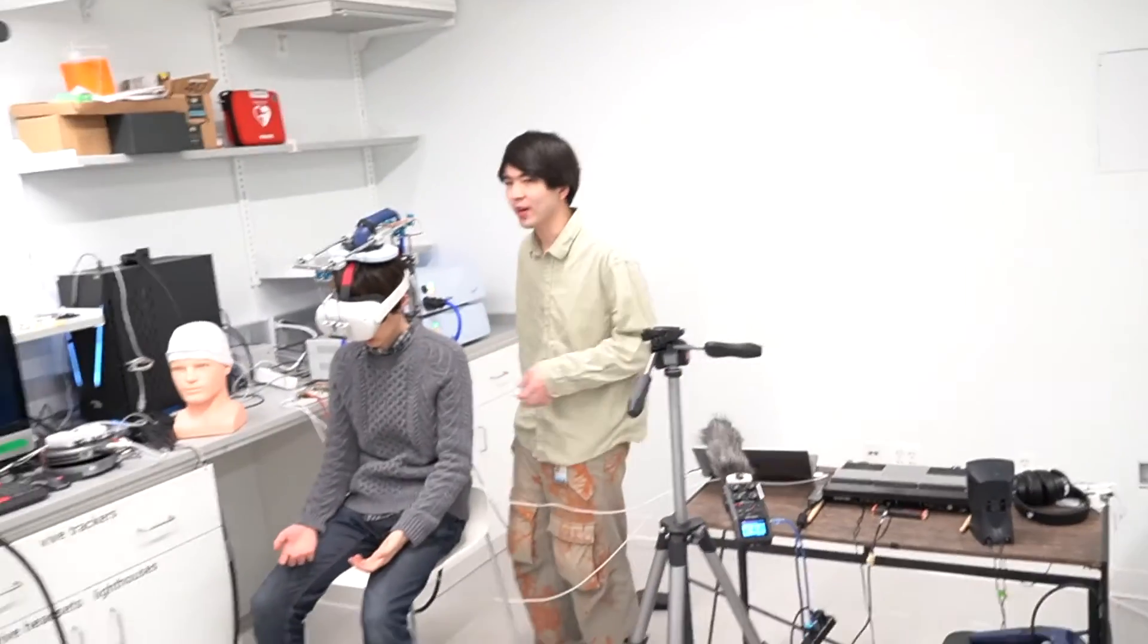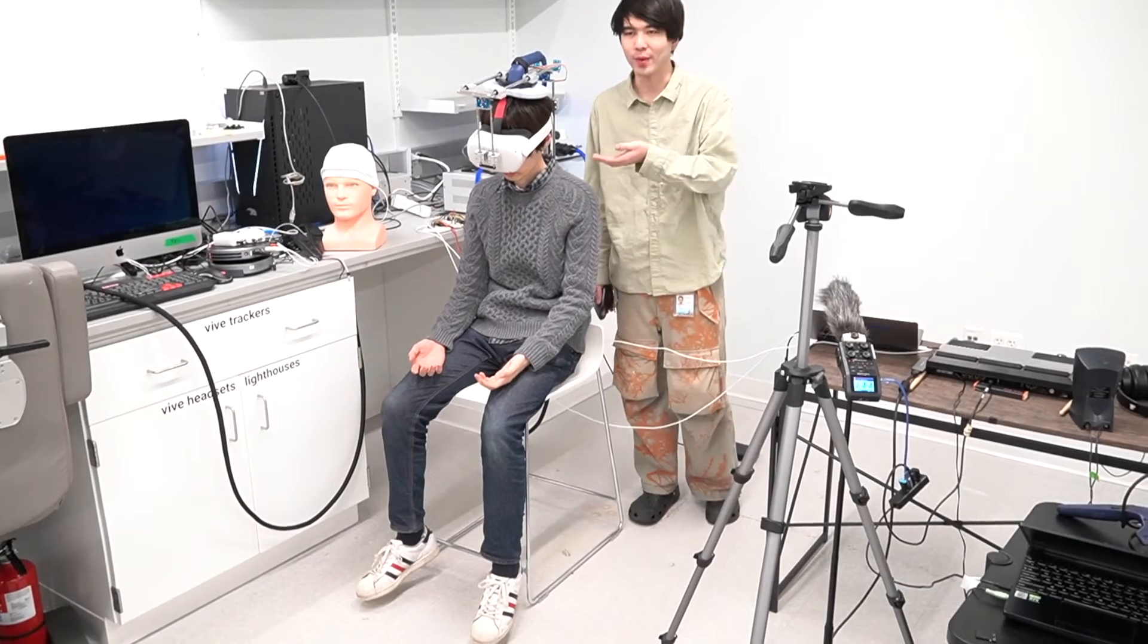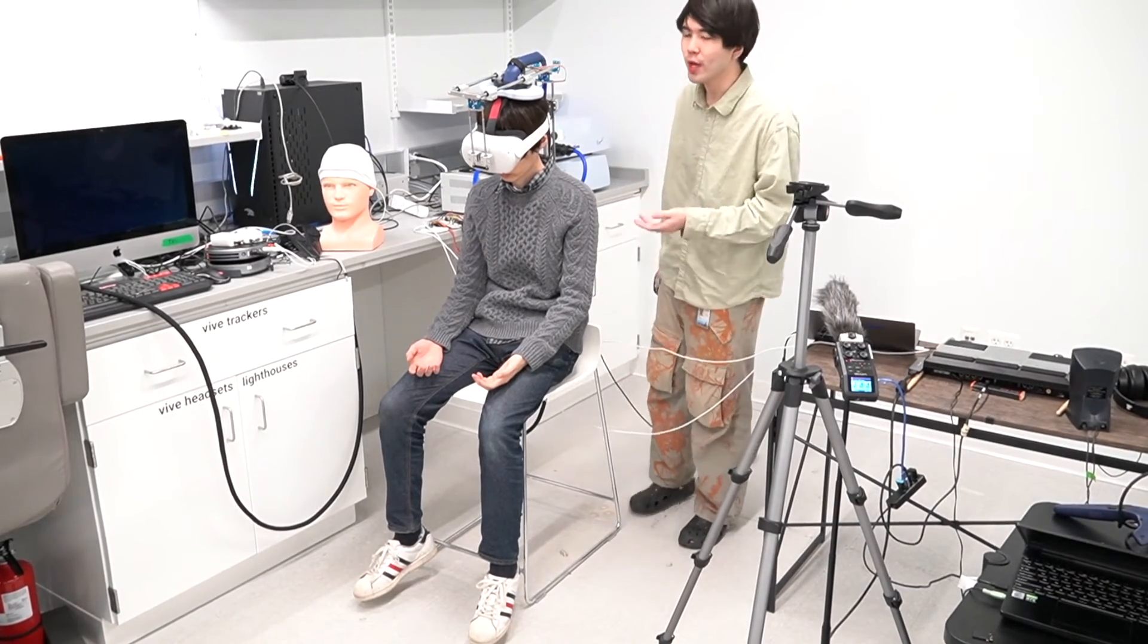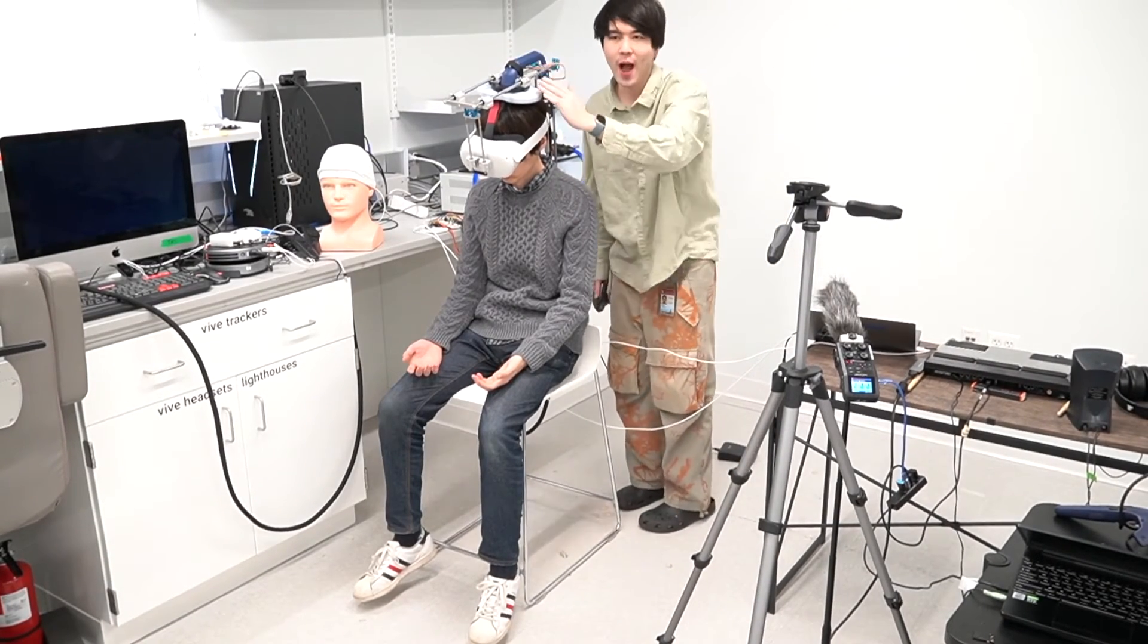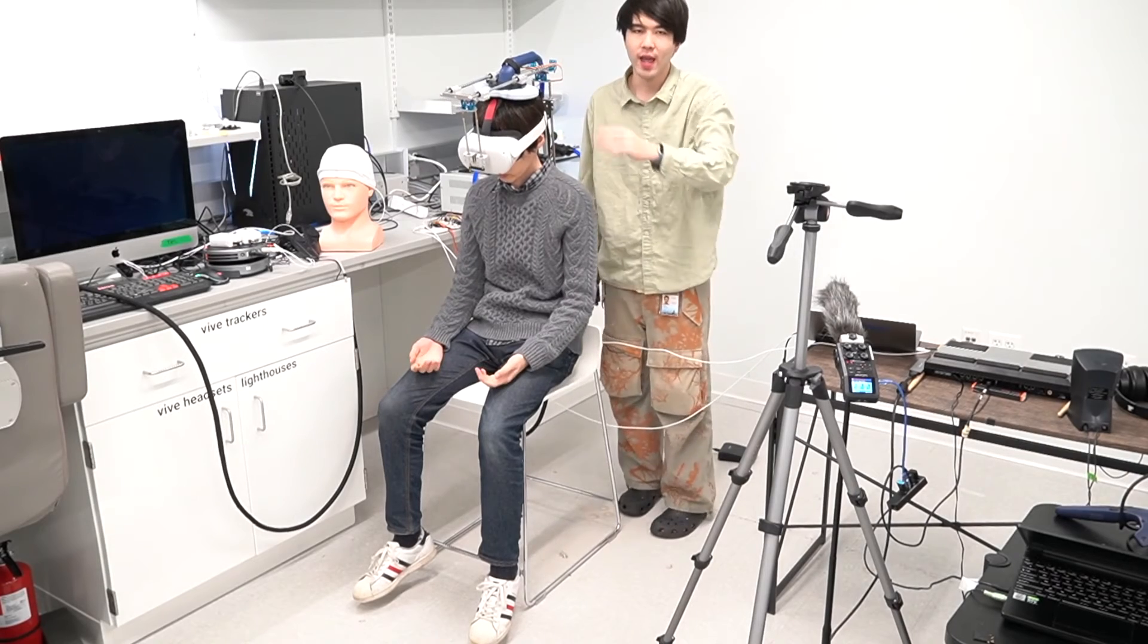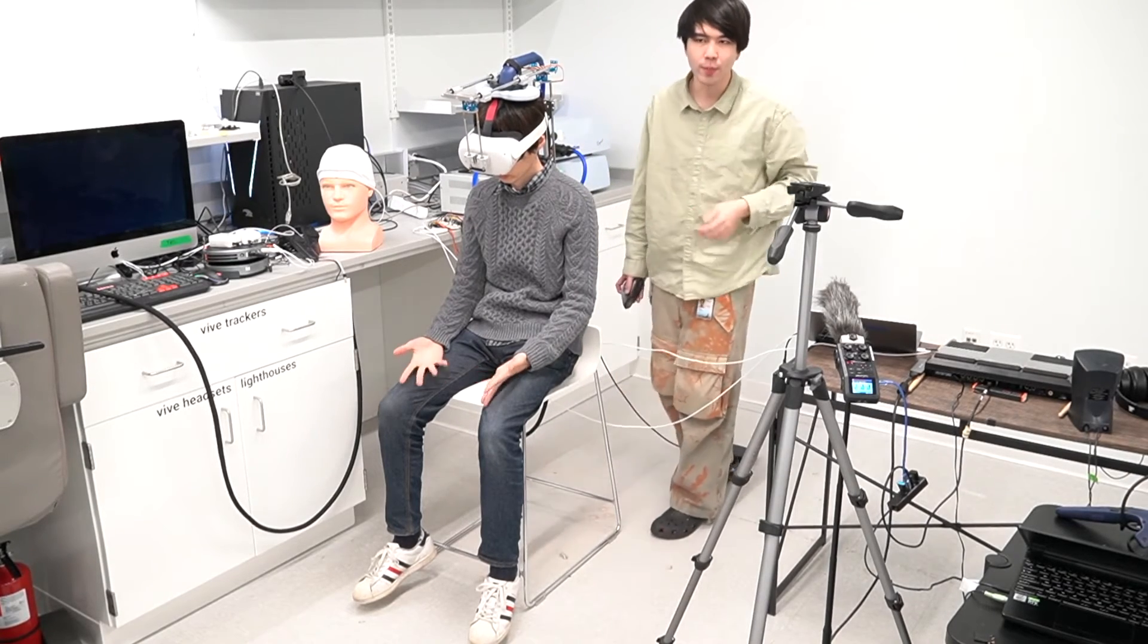So now let's see how our source effector can actually reach to even more different brain areas and create sensations across the user's body. So here comes my colleague, Aki, wearing our device. And what we are going to do is, our device moves this coil across the span of Aki's brain cortex and we stimulate different regions of his brain and see what happens.